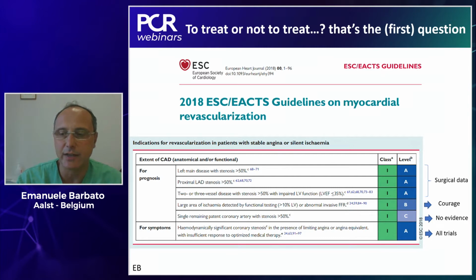If they are with us, please show that you are interested in what we are telling by telling us whether you would embark in this revascularization, whether you would do PCI in this case, whether you would send the patient to the surgeons, or whether you would do nothing, just medical therapy. The three options are open, as Flavio was alluding to. But let's see what the guidelines are saying in this specific case.